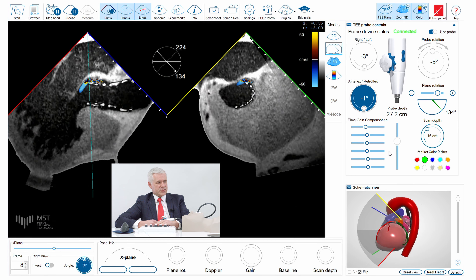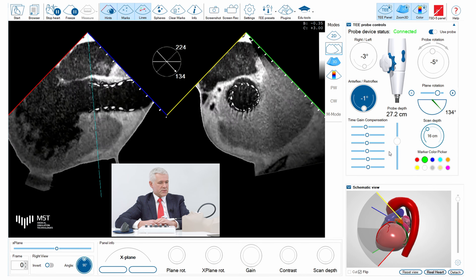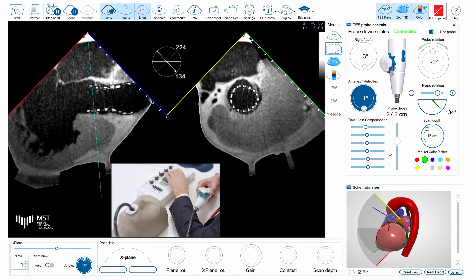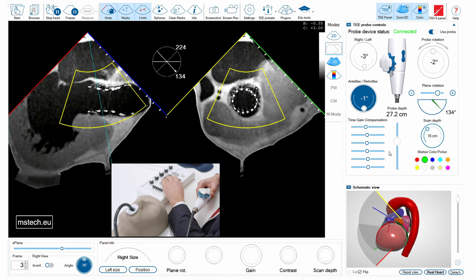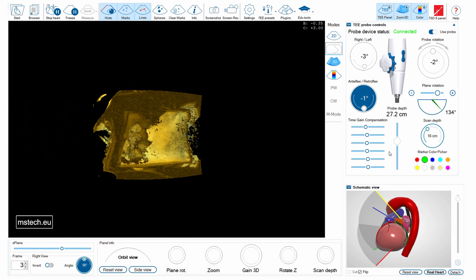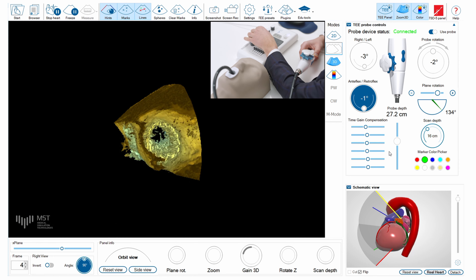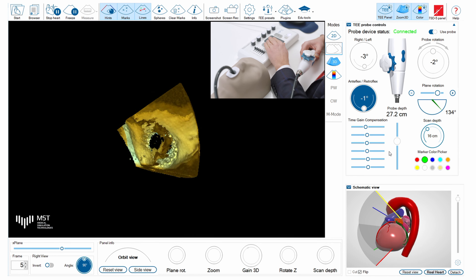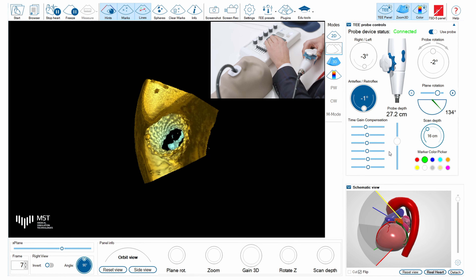So we can say that this is a trace, normal finding in a patient post TAVI implantation. We can also switch to the 3D mode, change slightly the region of interest, and now we can see — after adjusting the gain of this imaging — the stent inside the aorta from one side and from the other side.